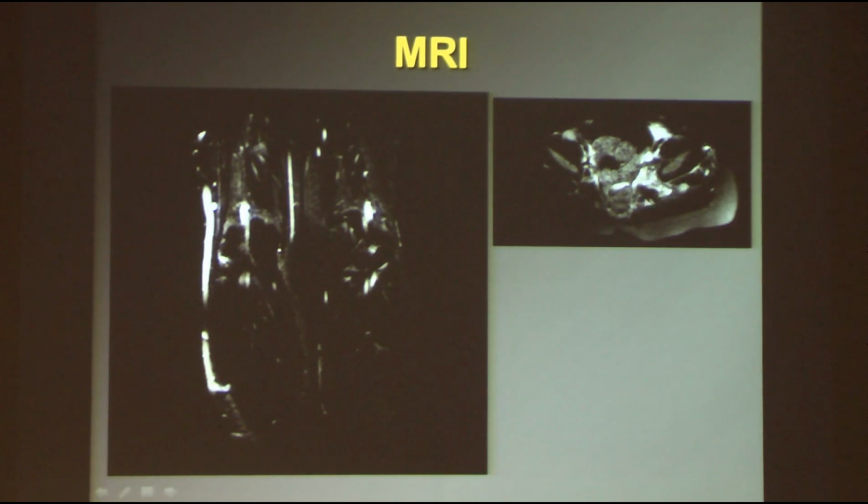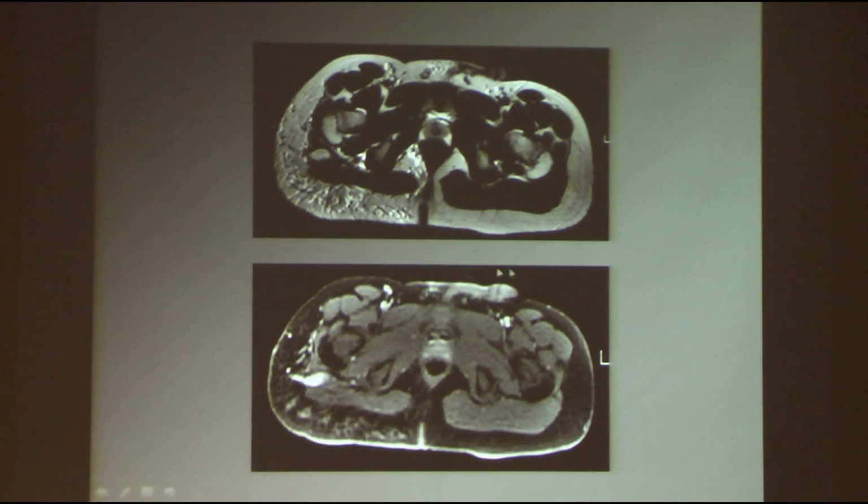And here you see some of the anomalous veins, the sciatic veins, posteriorly. So the sciatic veins aren't in the same plane as the other, the deep veins. Another MRI showing when you use contrast. This is without contrast. You see a lot of white things. With contrast, it shows you that this thing enhances. That's your sciatic vein coming in at the back.